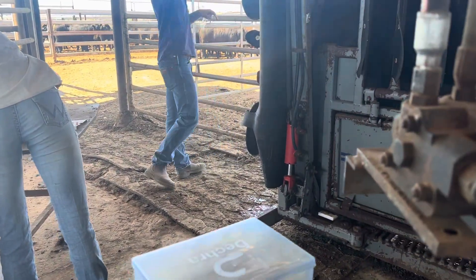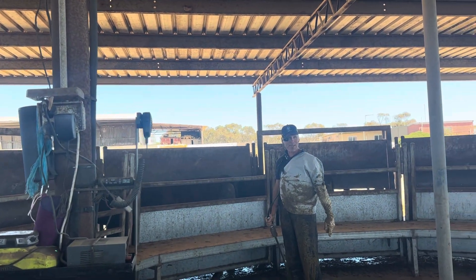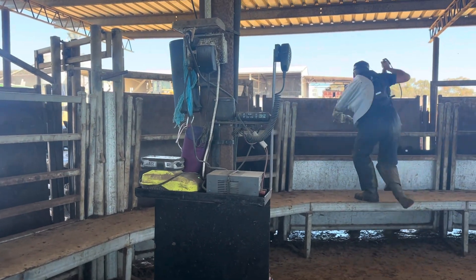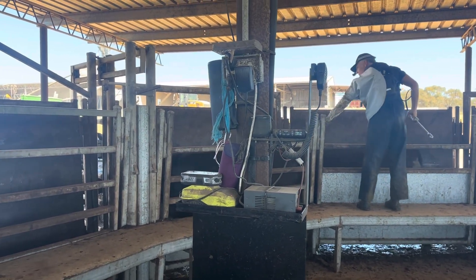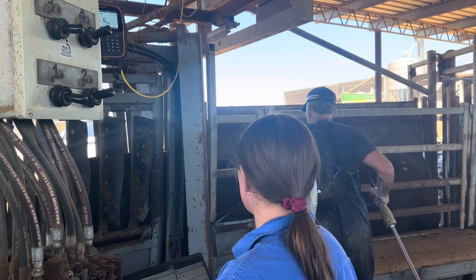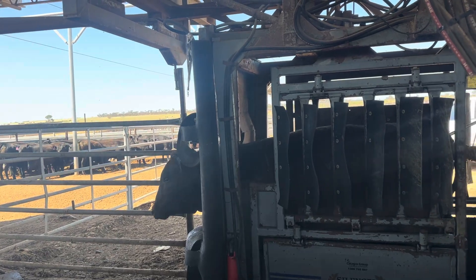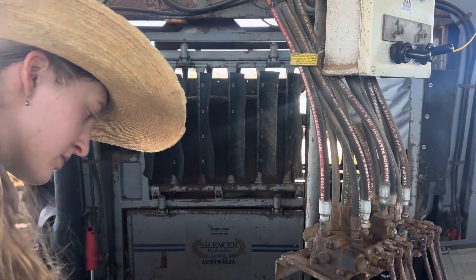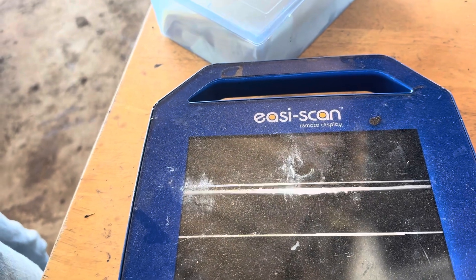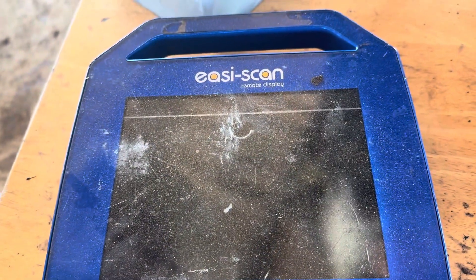Yes, we're going to have the boss man. You want to type it? Everyone look alive. Come on, Nick, get in there. That's pretty much what it looks like up here — empty. If she's got any urine in her bladder, will you see the bladder? She has her bladder right there. She's got a wee in her.